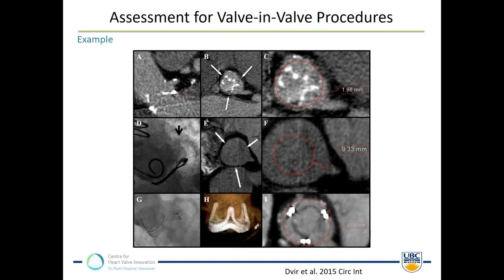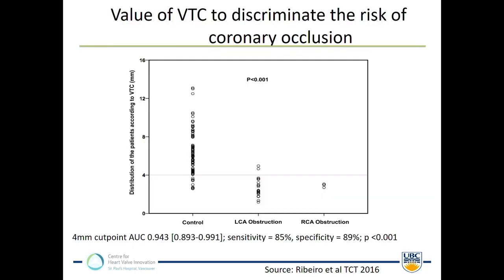So we proposed a number of years ago this fairly basic process of simply doing a virtual implantation, sized on the basis of the information provided for the surgical valve, although we're learning more and more, in the setting of unknown surgical valve size, how to use CT to actually define the surgical valve size. But assuming we know what it is, we deploy a ring of comparable size to what is intended to be deployed, and then we measure the distance between the virtual ring and the coronary ostia.